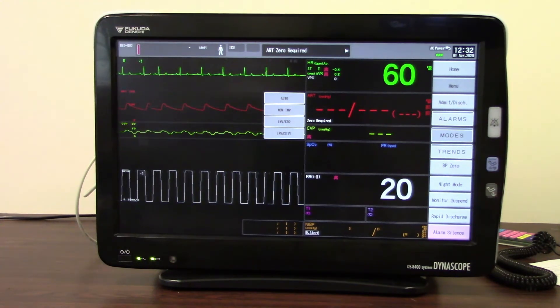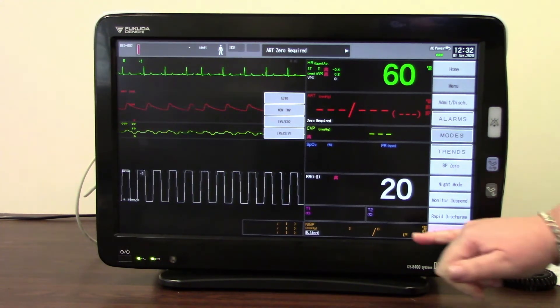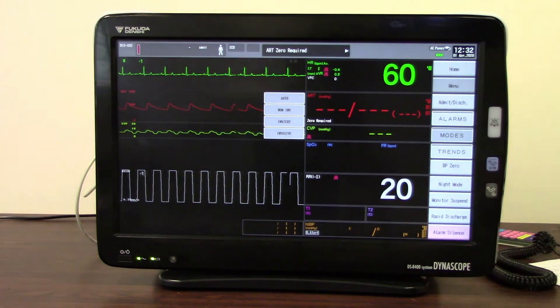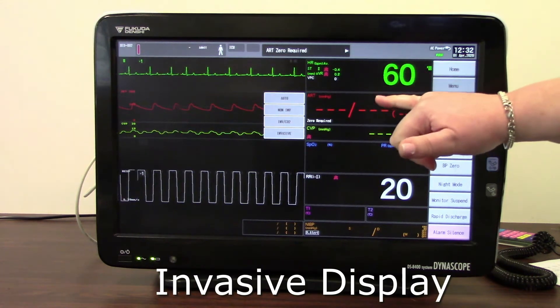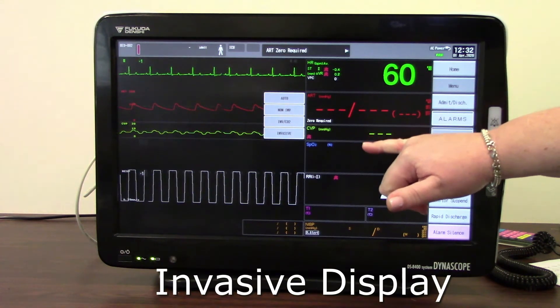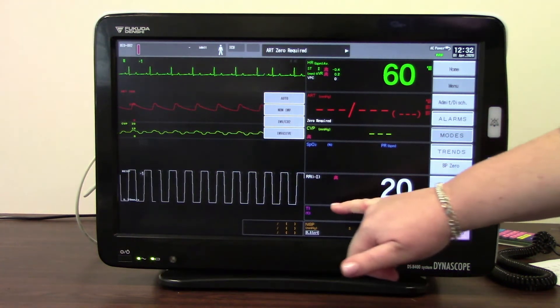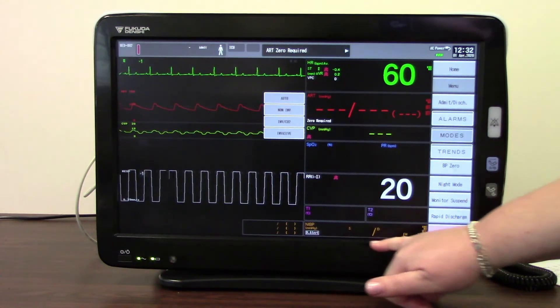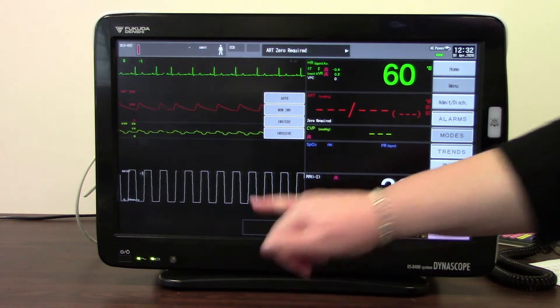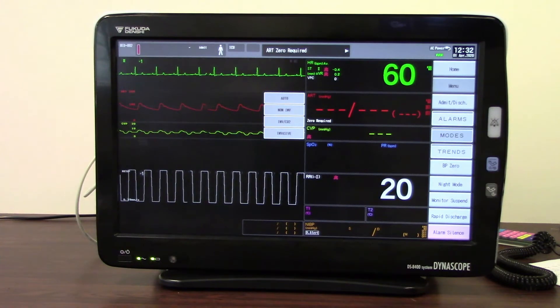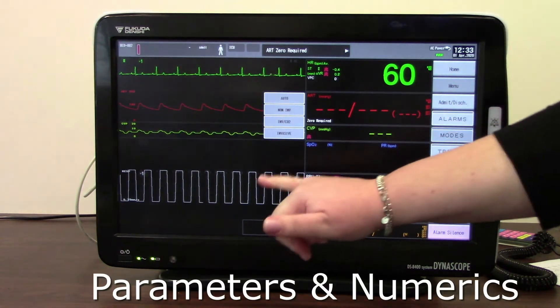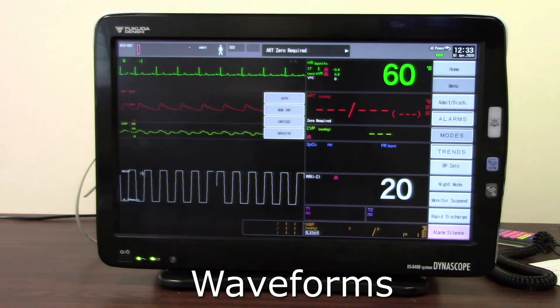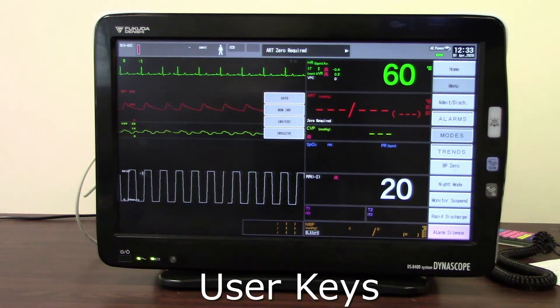The display that we've currently got showing is our invasive display. So this is an ICU monitor setup and we've got heart rate, arterial, CVP, oxygen saturation, RESPs, two temperatures, and our non-invasive blood pressure and non-invasive blood pressure list. We have our parameter area here and we have our waveform area here and user keys down the side.